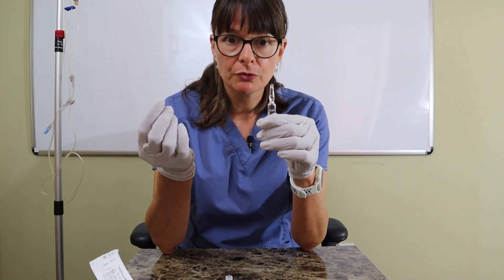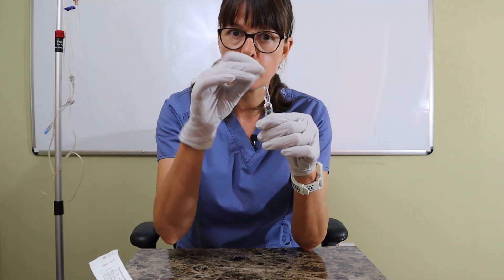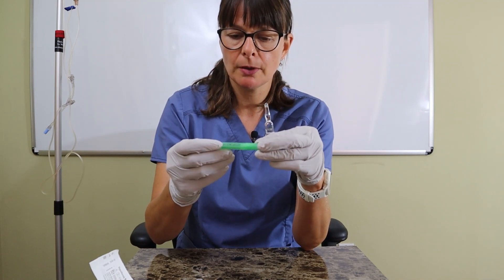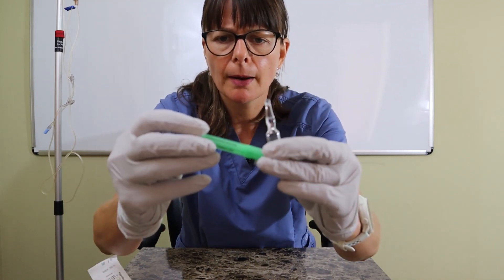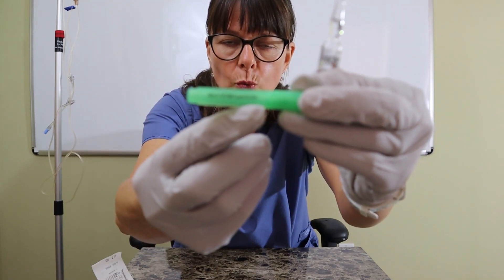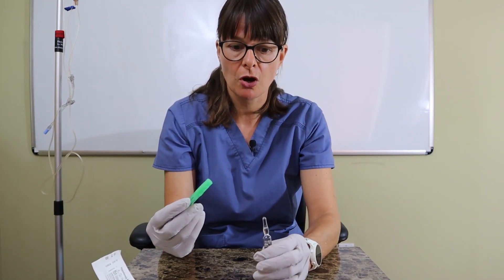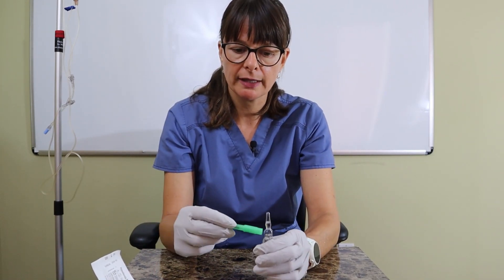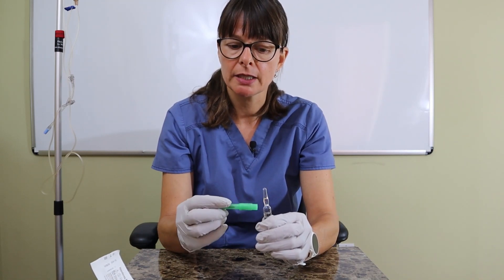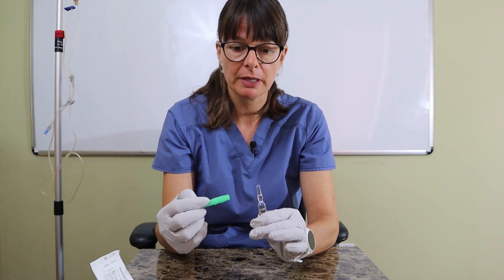I have a couple of nifty tools: a device that helps me break the cap without cutting myself, and a special filter needle. It's an 18 gauge needle with a filter. These special filter needles or filter straws make sure that if a glass fragment gets into the vial after you break it, it gets filtered out by the needle and not drawn up into the syringe.